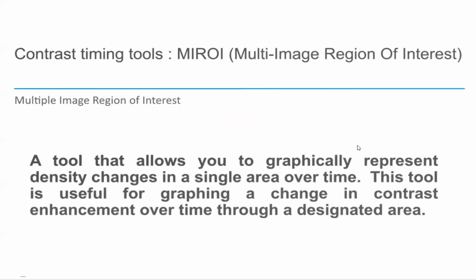So let's do the next topic. Let's talk about contrast timing tools using the multi-image region of interest. The other tool that we have is MIROI, which stands for multi-image region of interest.